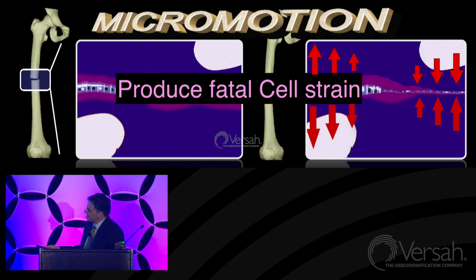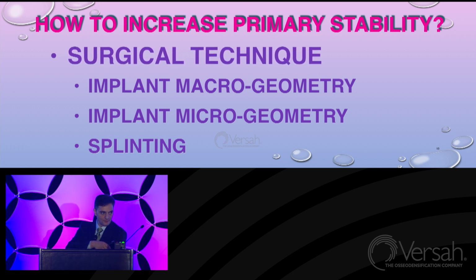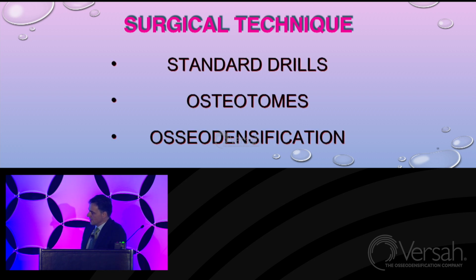How can we increase this primary stability? We can increase it by changing the surgical technique, changing the geometry of the implant, changing the micro surface, the micro geometry of the implant, or by rigidly splinting more implants to each other. Today we will focus on the first topic, which is the surgical technique. In the literature, as we have seen from previous speakers, we have different possibilities to prepare the implant site: the standard drilling technique, osteotomes, and today we have these new tools, which is osseodensification.